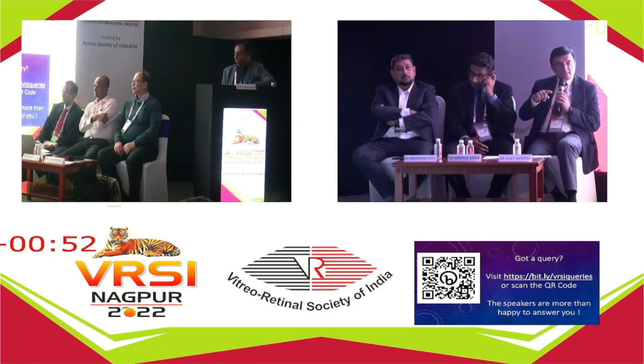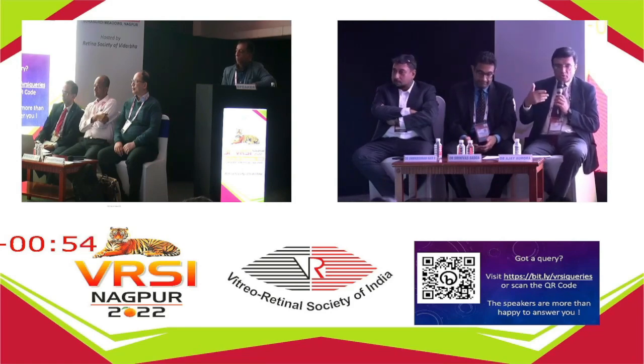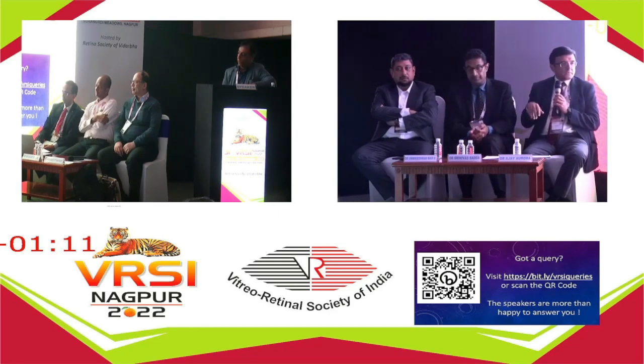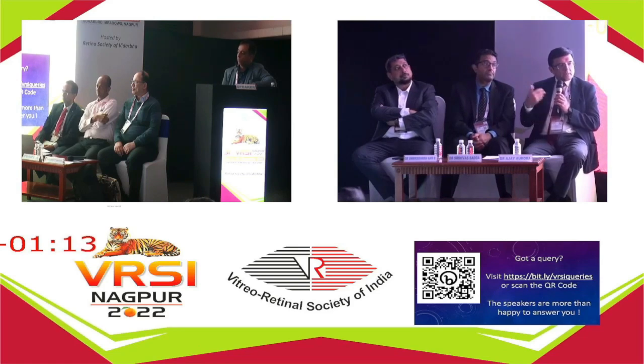Second thing is, because we have a Mirante, we've got to get used to the multicolor image. When you get a multicolor image, it gives you an option of going to the blue channel, green channel, and the red channel. You look at each of them, and then again you look back at the multicolor, it gives you a lot more. It's a learning process.